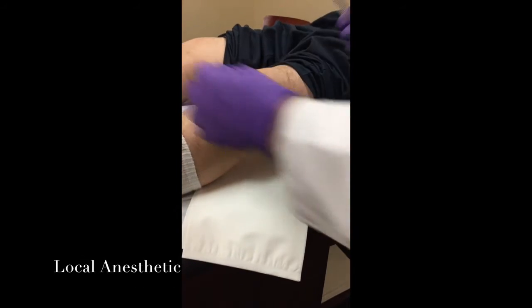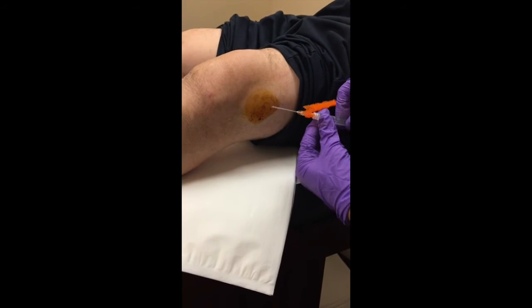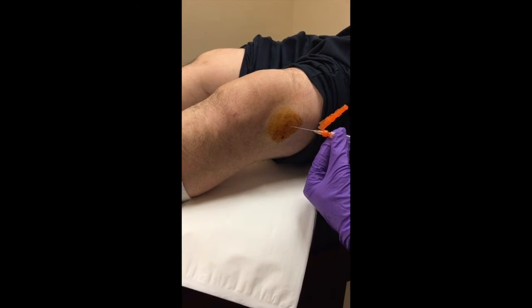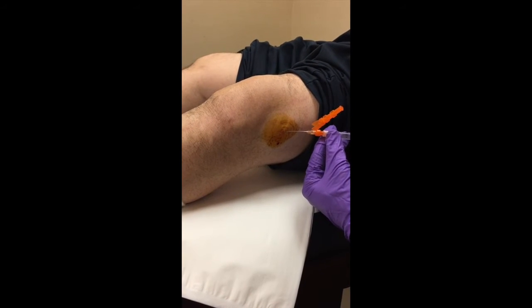We're going to create a small wheal right underneath the skin — you're going to feel a pinch. On three: one, two, three — small pinch, then a little burn sensation as we create the wheal. We make it nice and big.